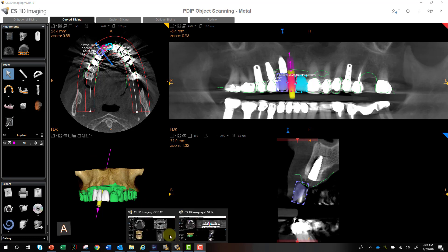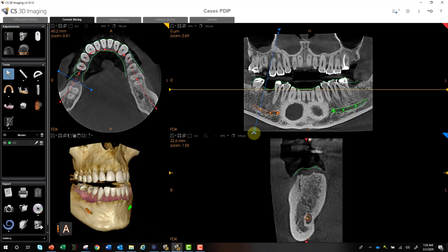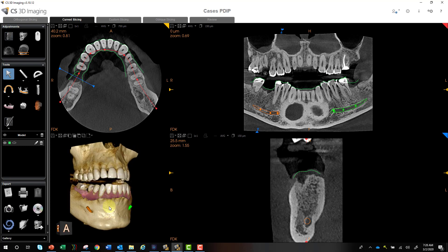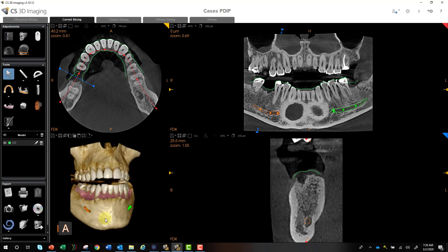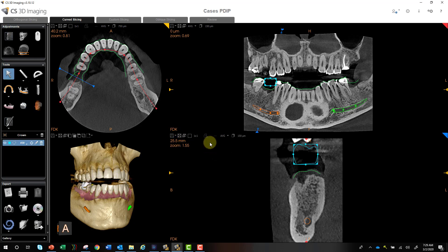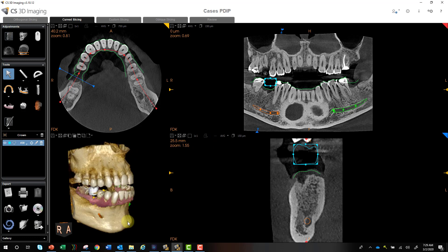So now let's go back to our original plan — this is where we left off. We've got our cross-sectionals positioned nicely on the lower right side, we've got our model merged, our digital impression, NURBS are mapped out, so we're ready to add a crown. This is part of the PDIP module, so if you don't have this you can ask your dealer or your rep. We're going to select number 30, and it places our crown in the general vicinity, and now we're ready to design and position it.